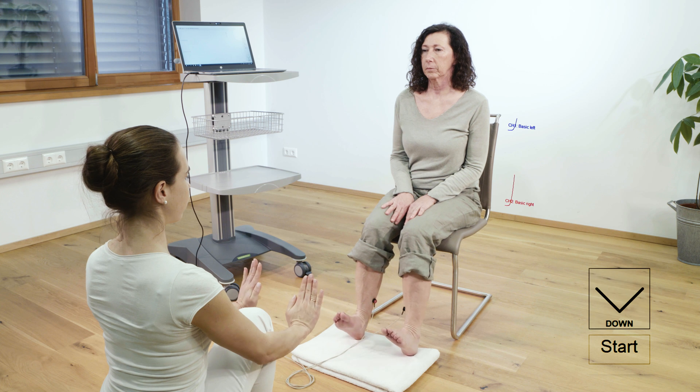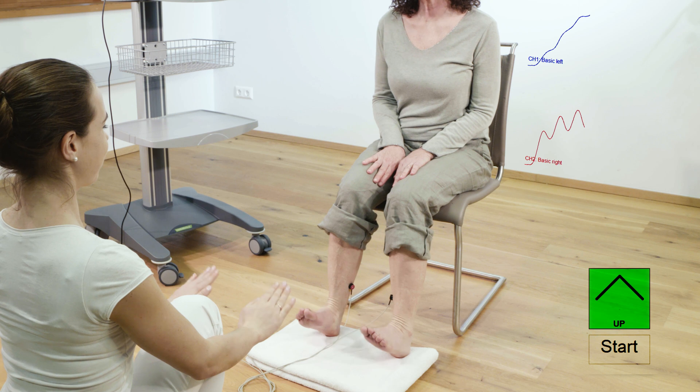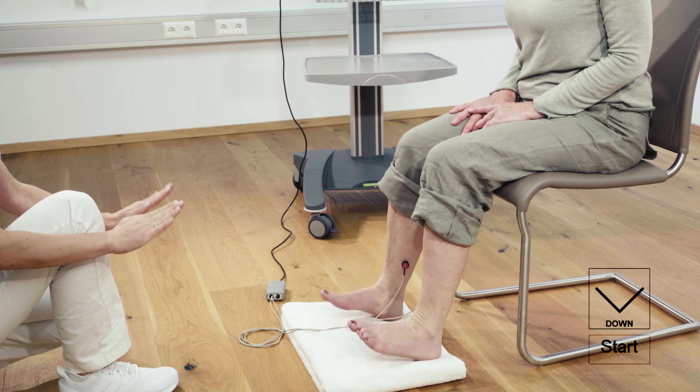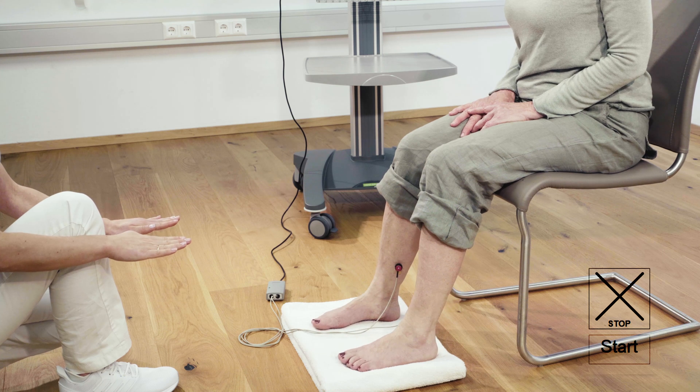The patient should now operate the muscle pump with eight powerful dorsal flexions. These pumping movements are optically displayed in the lower right of the screen and accompanied by acoustic signals. In the process, venous blood is pumped out of the venous system.